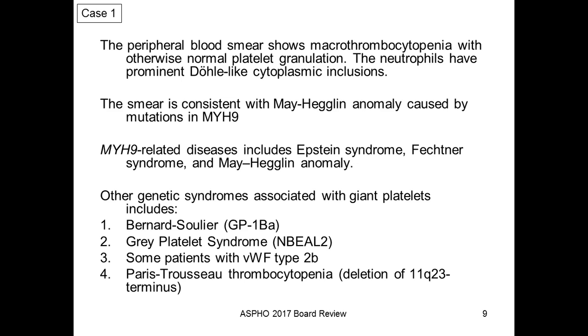Other genetic syndromes associated with giant platelets or macrothrombocytopenia include Bernard-Soulier, gray platelet syndrome, some cases of von Willebrand disease type 2B, and Paris-Trousseau thrombocytopenia. And I've given the genes involved.